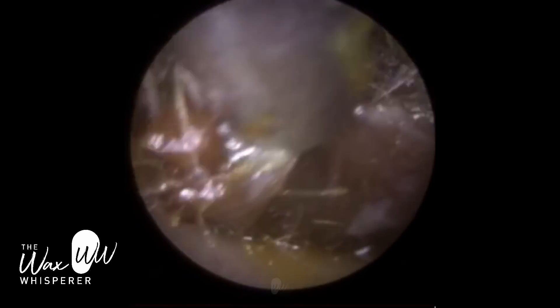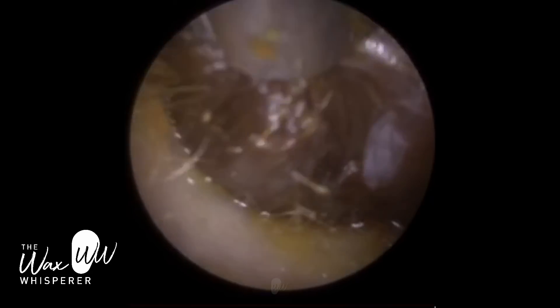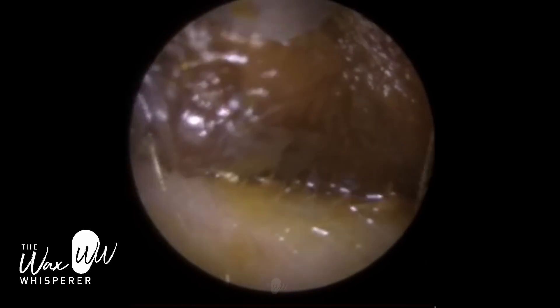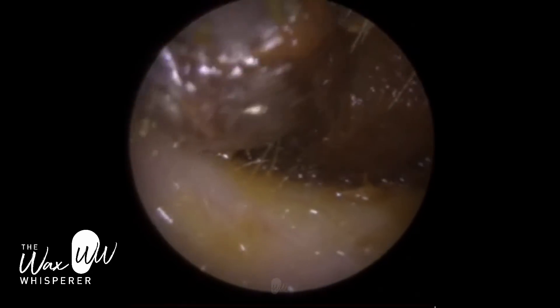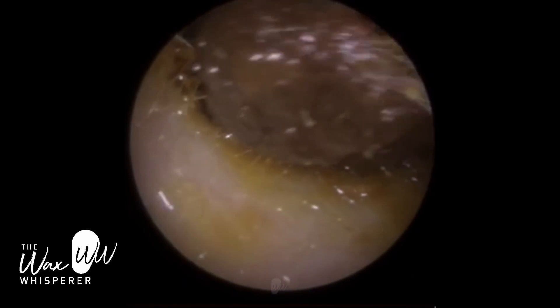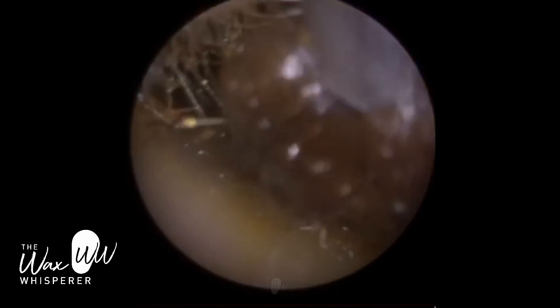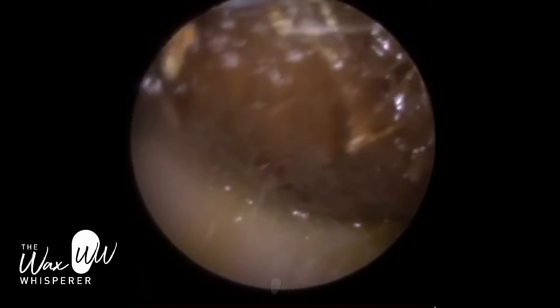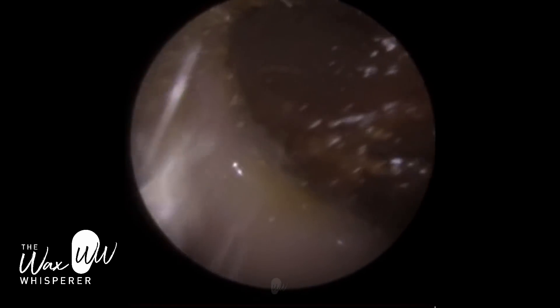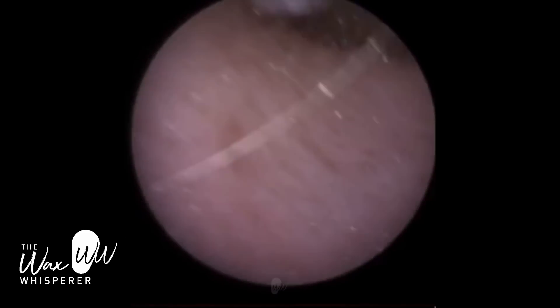What's critical when removing a big piece of earwax is to lift the wax off the canal walls. There's often a layer of dead skin coating it — you can see at the bottom of the earwax there's a glossy white thin layer of dead skin, and we've gently peeled that off the ear canal, which releases the wax and allows me to extract it. Running this wax forwards, it's near the entrance now — we know that because you can start to see the cilia, which are the hairs in the ear. Cilia are located almost exclusively in the outer third, the cartilage portion. It's very rare to see cilia on the bony part of the ear canal, the inner two-thirds, because all the hair follicles are located in the outer third. You can see the full length of this wax now — that's the distal end and the medial end — and you can see the patient's ear anatomy with the bend going up and coming back down again.